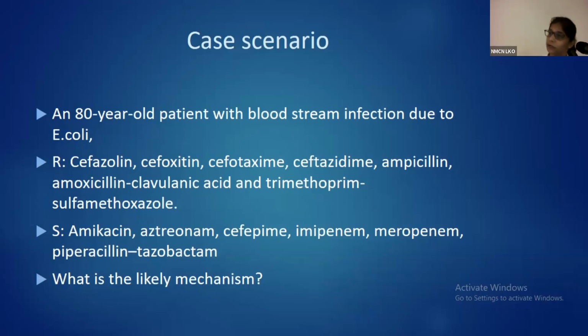Have you heard of AmpC? AmpC beta-lactamases? Yes, this is the likely mechanism, AmpC beta-lactamases. Because AmpC beta-lactamases respond to cefepime, although they are resistant to many cephalosporins, cefepime works for AmpC beta-lactamases. And carbapenems are also the agents of choice for treatment of AmpC beta-lactamase pathogens. So this is most likely an AmpC.